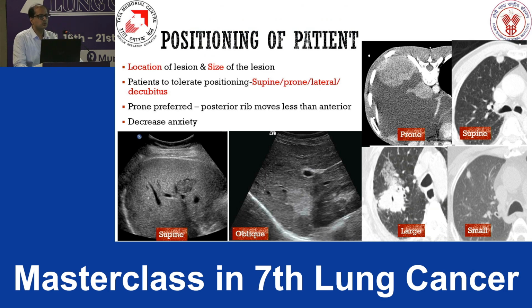Positioning of the patient is also equally important, because the chances of sampling error would be minimized if we are taking from the proper area, considering the location of the lesion and the size of the lesion. Obviously, the bigger the lesion, the better it is, because you can take more tissue. This is a posteriorly located lesion, so the biopsy needs to be planned in a prone position. This is a small nodule which needs to be targeted from the anterior approach, and this is a supine approach. When the lesion is larger, the chances of central necrosis are much more evident, and we need to target the periphery of the lesion.